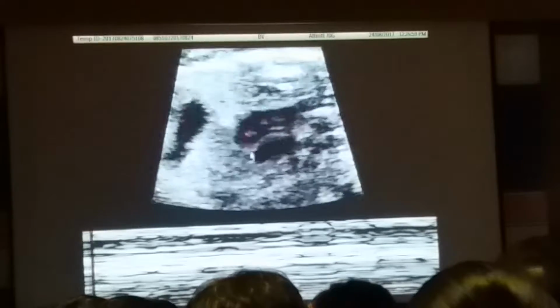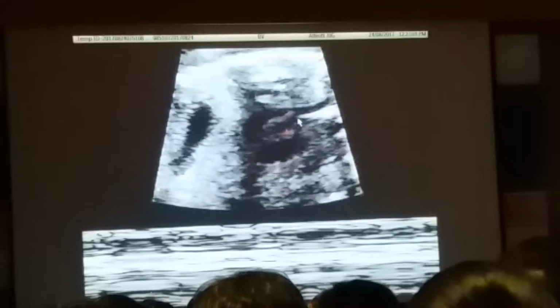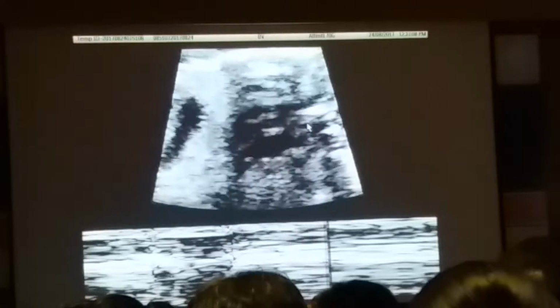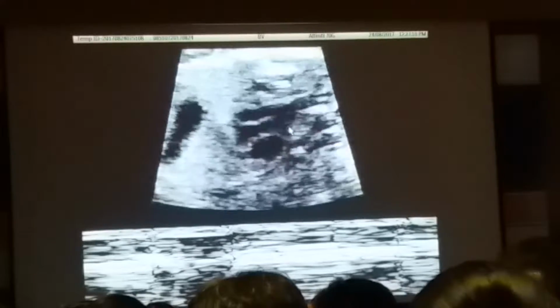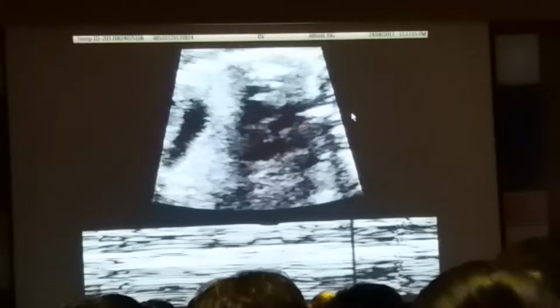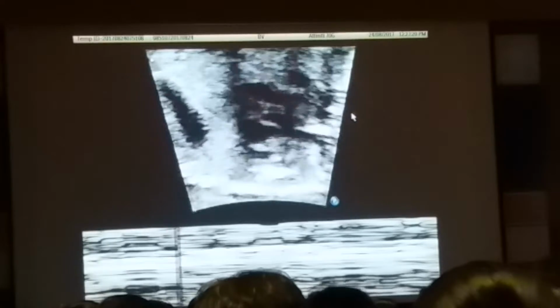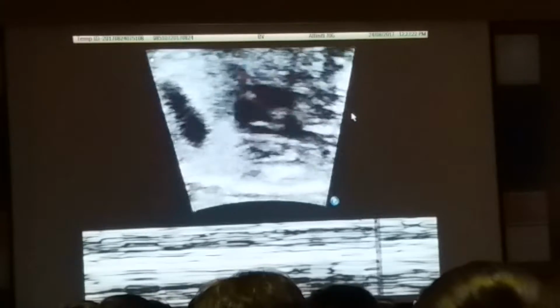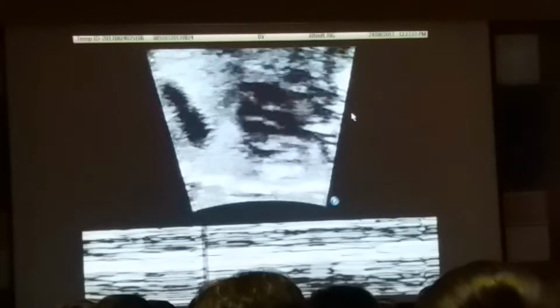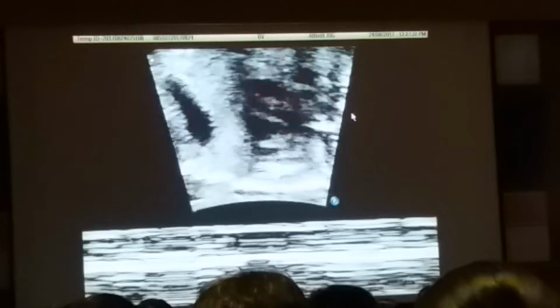This is the left ventricle. This is the right ventricle. And there's the aorta going up this way. So that's a long axis view. Is there a switch up down here somewhere? Boy, you don't make it easy here. Give me an I-33. Okay, so now there's a classical look, just like I showed you on the echo, on the long axis before. That's the long axis view.